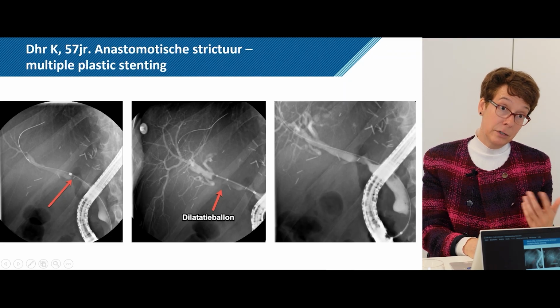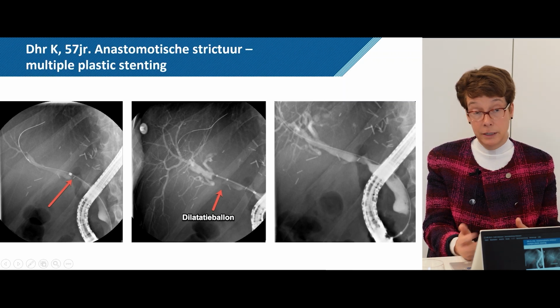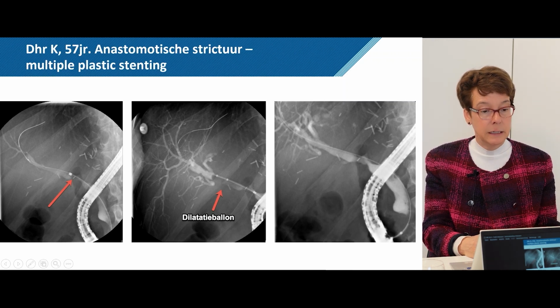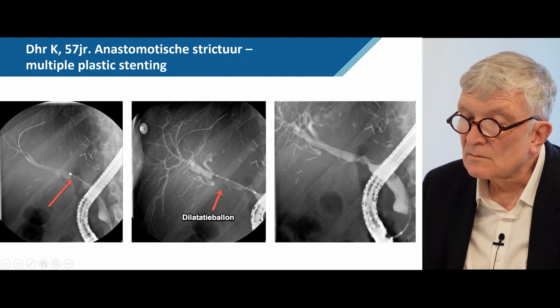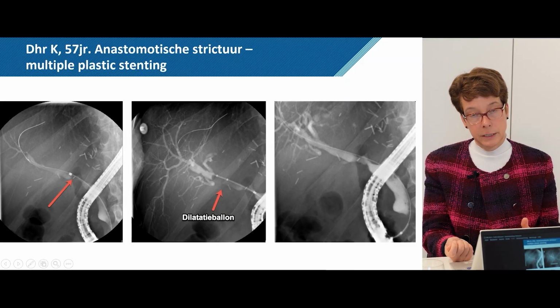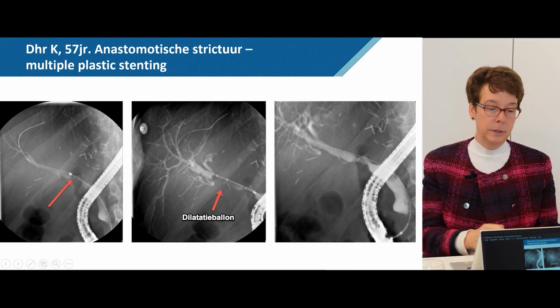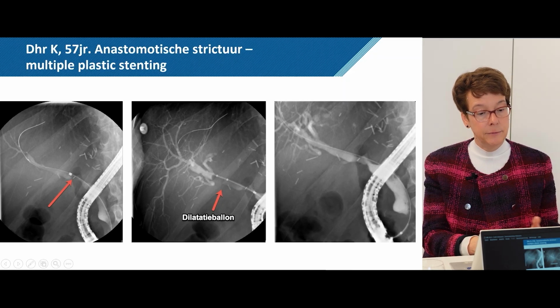So you go back, you reschedule. I tend to go in, if I have done a sphincterotomy before, I directly cannulate with an extraction balloon. I make again a cholangiogram, and what I like with the extraction balloon is that I can feel the stricture. So if you go down, you really feel the stricture, and in first instance I would dilate.